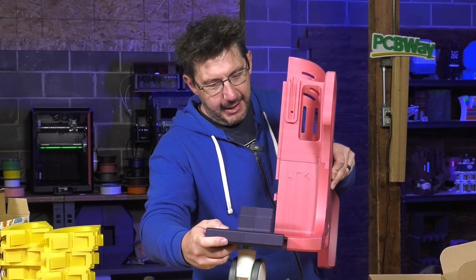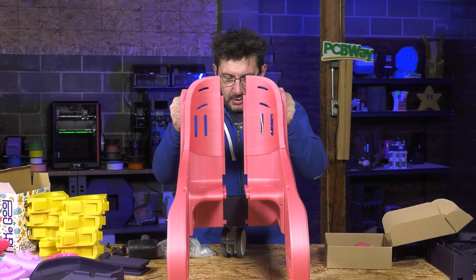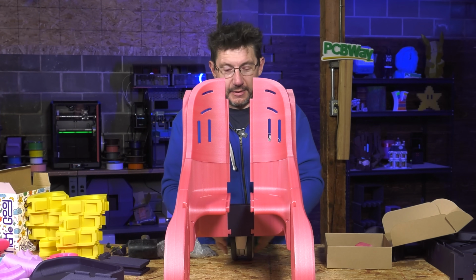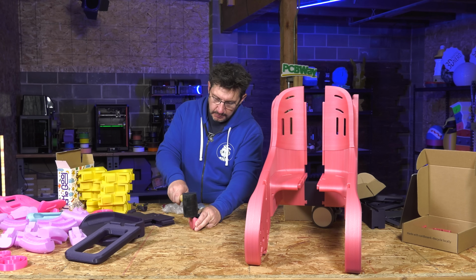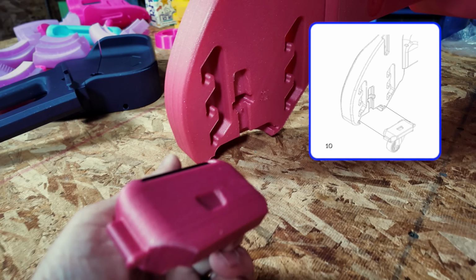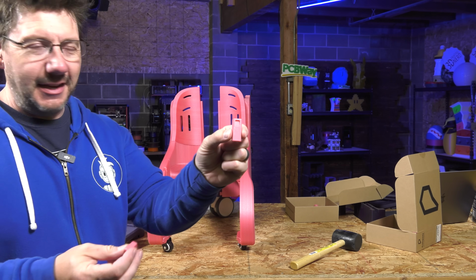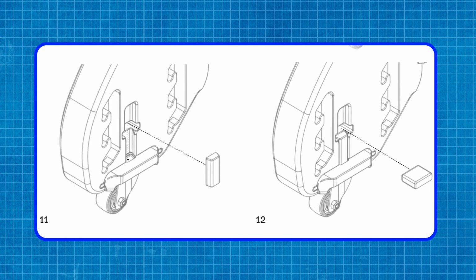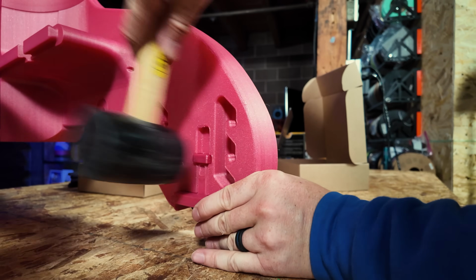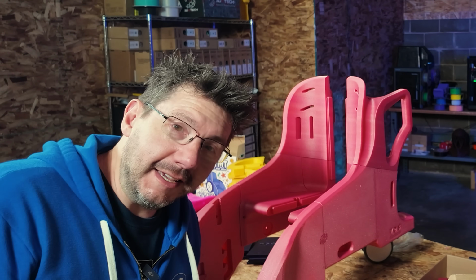This piece is gonna come in like that. There you go. So you can see with just a few pieces that we put together, we're this far. It does say to insert these like so and tap lightly. That's what you want to do. These are gonna go in this place right there. It's hard to see, but there's these tiny pieces. I think you can see them, and they look like that. But it's this really ingenious method for locking the casters in on either side. I'd put it in the wrong way. So I'm taking it out and putting it in the correct way.